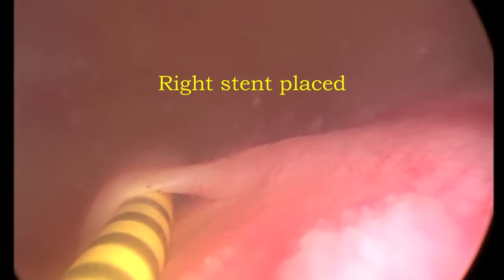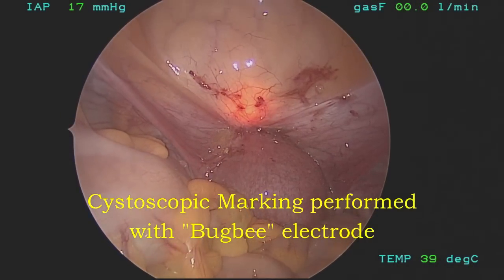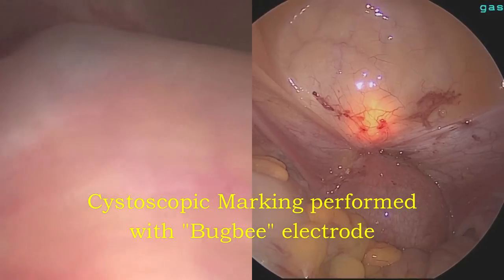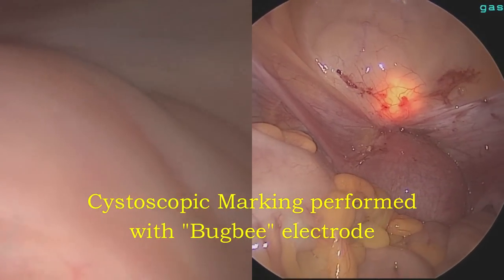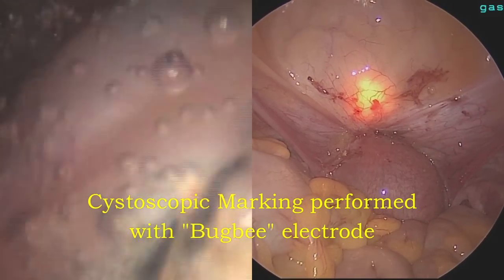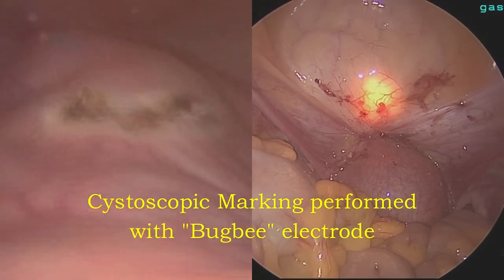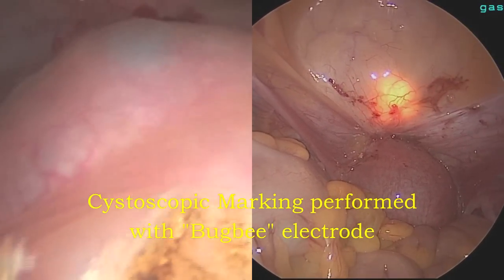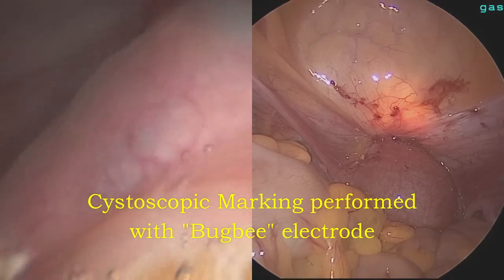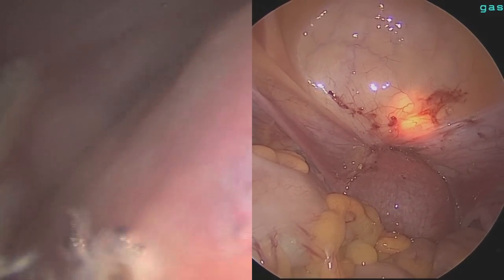Here you can see that the left stent is being inserted, followed by the right side. Now the surgery will begin by marking the lesion. Here you can see the cystoscope is present, and a Bugbee electrode is utilized by the urologist to clearly outline the lesion. This will be extremely helpful laparoscopically when entering the bladder so that the margins of the lesion can be easily seen, therefore allowing for complete resection of the lesion.